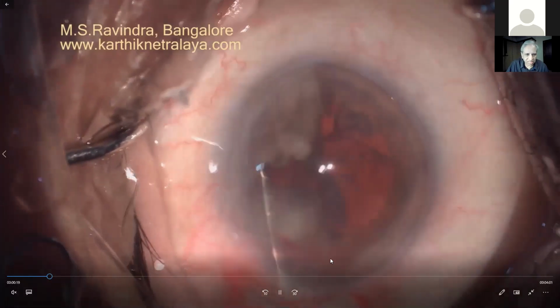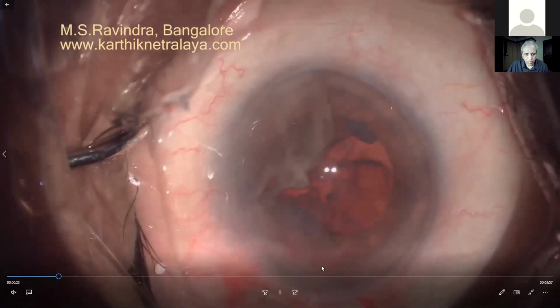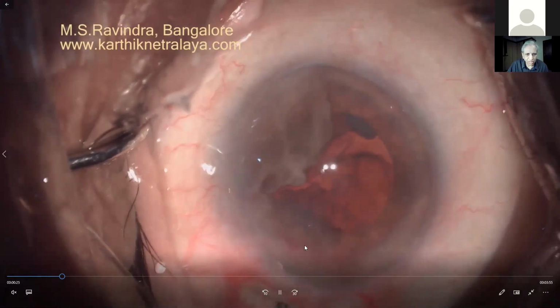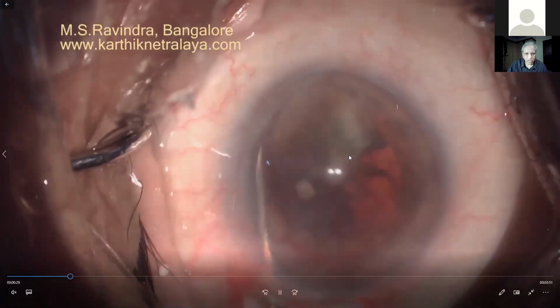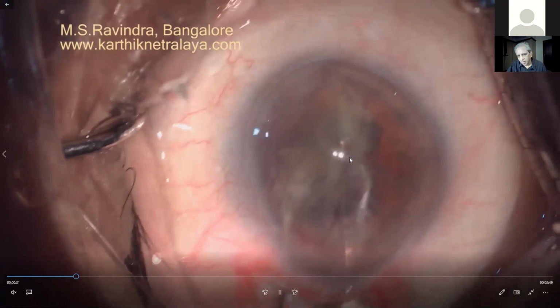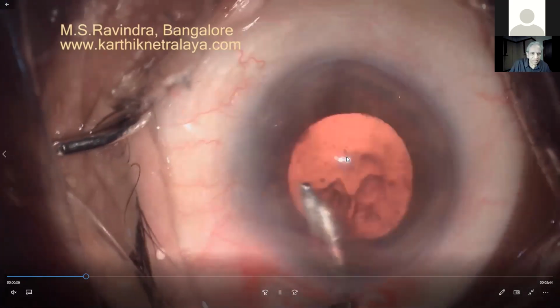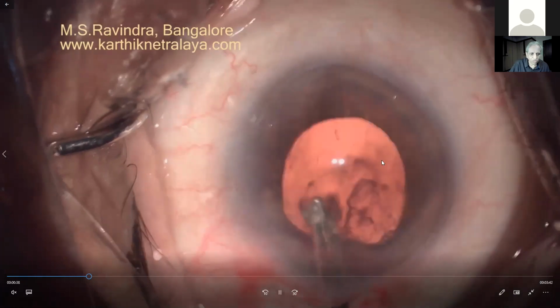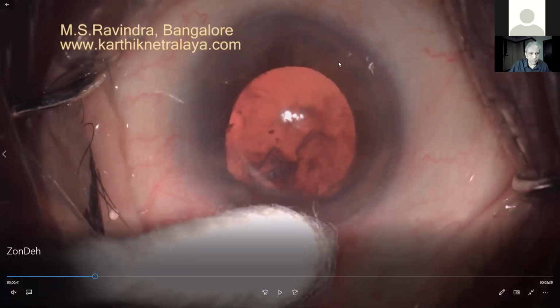This cannula is injecting visco continuously into the anterior chamber. I'm just opening the tunnel and guiding the nucleus to come outside, the part of epinucleus. I'm injecting in front of it so it doesn't rub. So you can see much of it has come out. Very carefully, there's no irrigation. It's almost like dry aspiration. Very little quantity of fluid is to be injected.